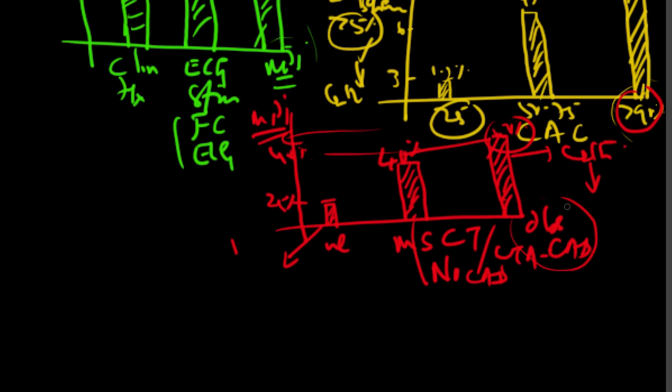And with obstructive CAD pattern seen on a CTA, only half the cases will actually require to be sent for cardiac cath, and those half cases must go via myocardial perfusion imaging. So this way we can ascertain which of those half cases were sent for cardiac cath, and not everybody goes for cardiac cath.